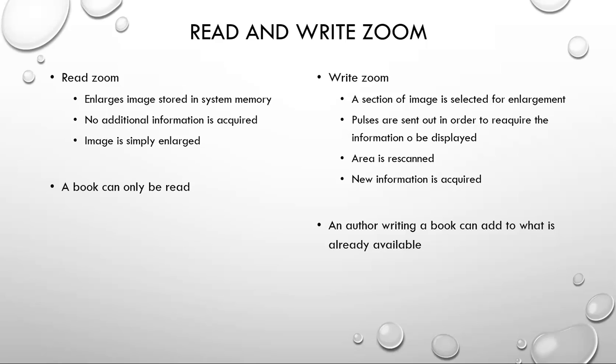Write zoom, on the other hand, allows you to be the author, and in this case a section of the image is selected for enlargement. It is re-insonated so that more image is obtained, new information is acquired, and we get a better look at that area.